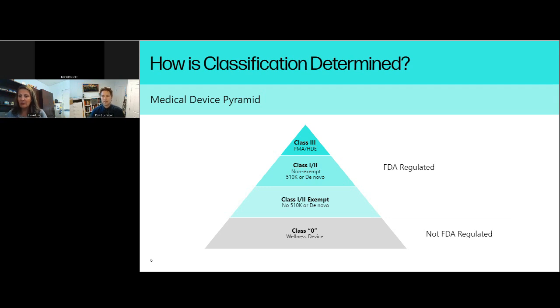As we talked about at AMUG, the problem with powder recycle is we're sort of learning as we go. And what's interesting is that back in 2016, when we started doing research on static properties of different additive manufacturer properties versus dynamic or fatigue performance of these devices, and then the impact of post-processing, there were only, I think, 3 types of additive manufacture machines. And now I think the last time I counted, there were 7 or 8.